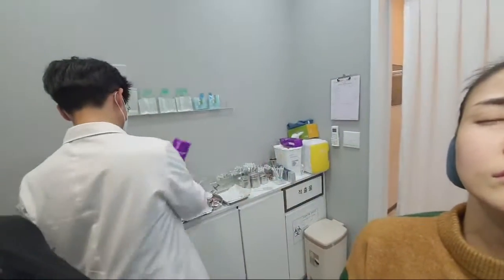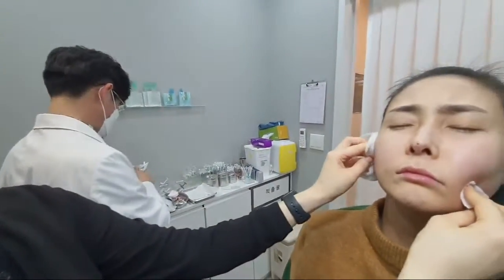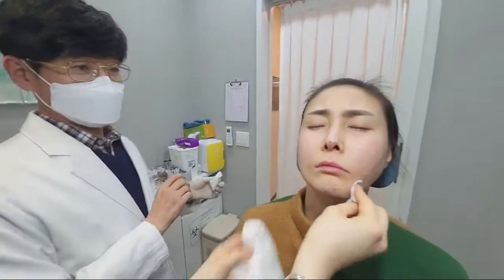Today we'll be working with Bellotero fillers. So using the injection in the Indian band area where the area appears to be sunken. The sunken area at the point that he's pointing, that's the Indian band area. And he's using the filler to make the area more voluminous.